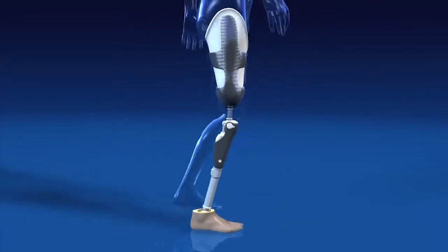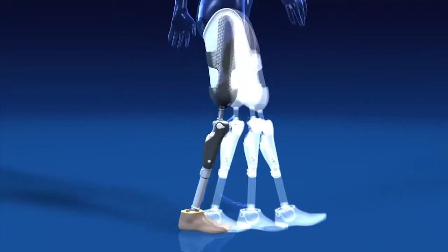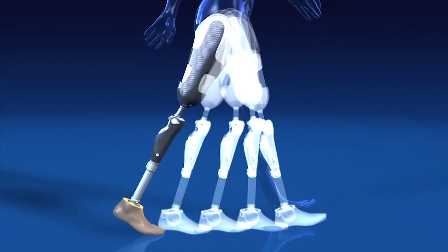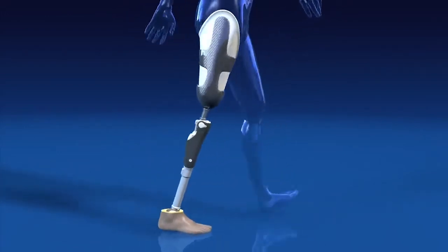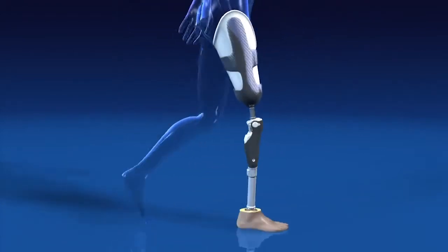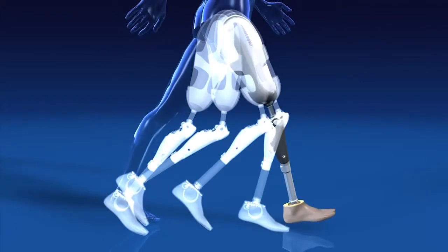Walking is divided into the stance phase and the swing phase. In the stance phase, the main task is stabilizing the leg so that it can support the body weight. Dynamic control is required in the swing phase, which means that the leg has to be controlled as it swings through, with the lower leg being slowed down in preparation for the next step.